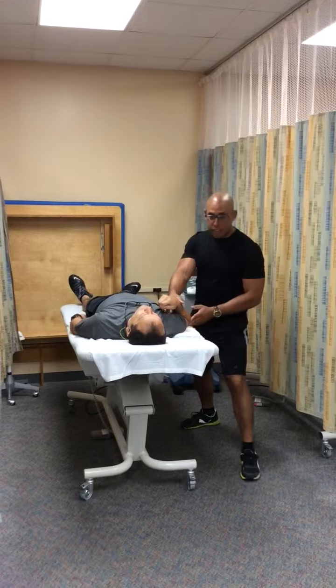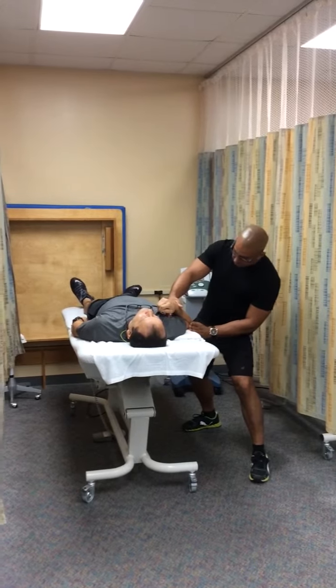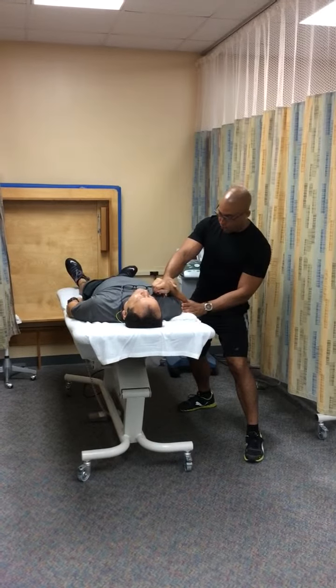I'm going to determine the end feel, and I'm going to make a visual estimate of the range of motion, which is approximately 150 degrees.